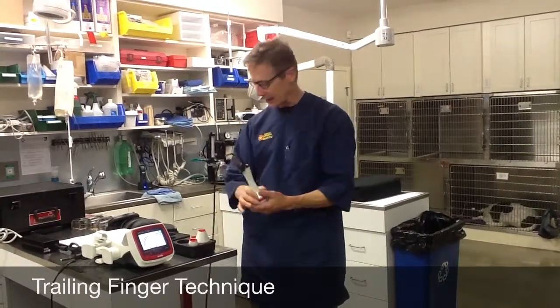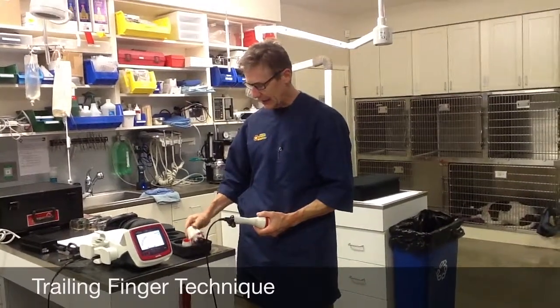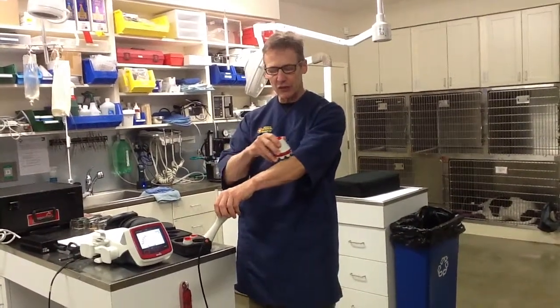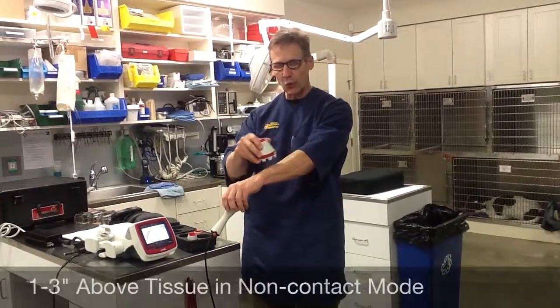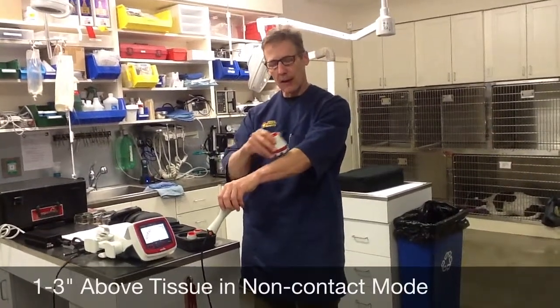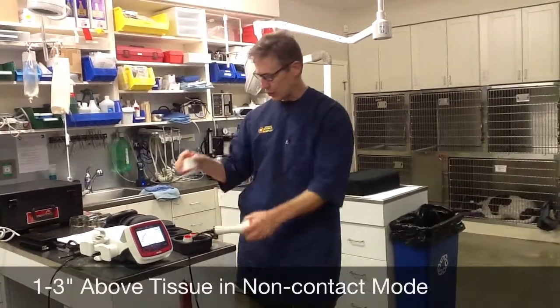If I'm in the non-contact mode with my non-contact head, I still want to move it 1 to 3 inches per second. But now I want to be above the tissue 1 to 3 inches. And 1 inch is better than 3 inches — you get better physics if you're closer to the tissue.